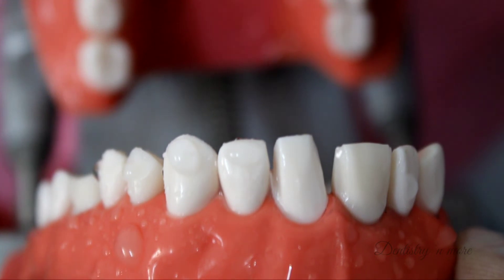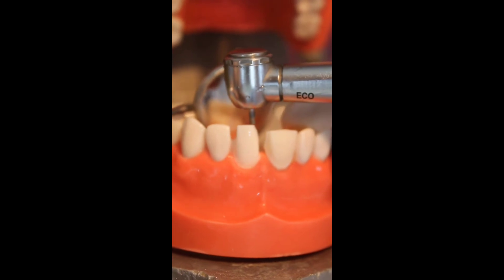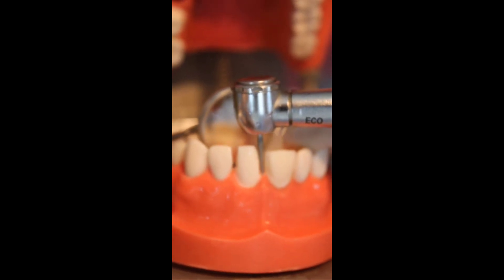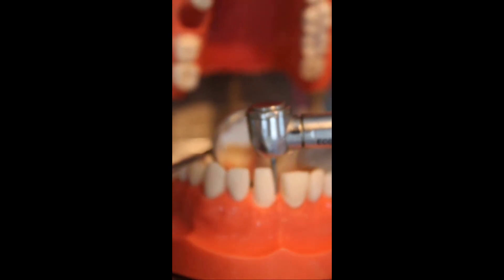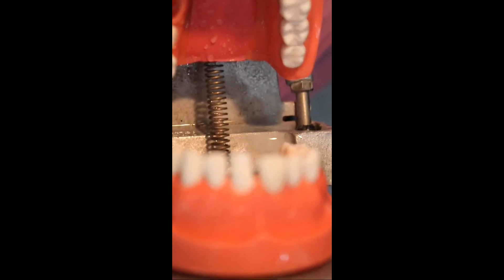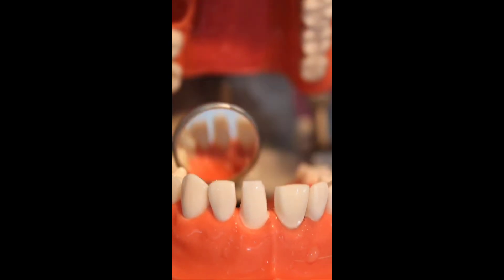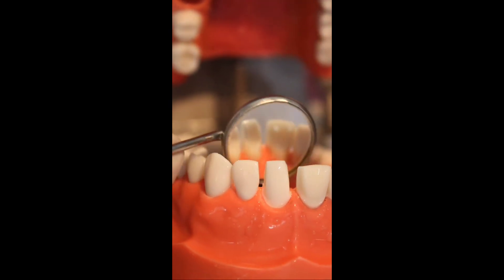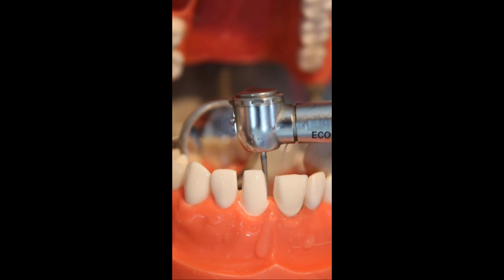The shoulder margin placed both mesially and distally should be at the same level of the gingiva — equi-gingival, or sub-gingivally if planning a sub-gingival margin. Moving on to the lingual reduction: I use a flattened tapered diamond. This is the most tricky and challenging part of the preparation as it is done in indirect vision. My technique is to do the lingual reduction in two halves — first focusing only on the mesial half, starting from the midline and moving towards the mesial aspect.